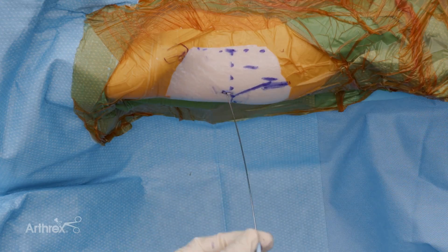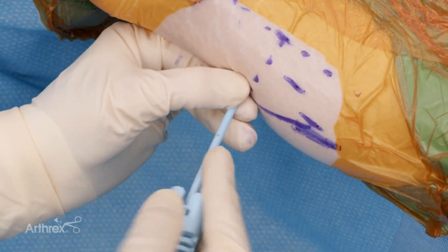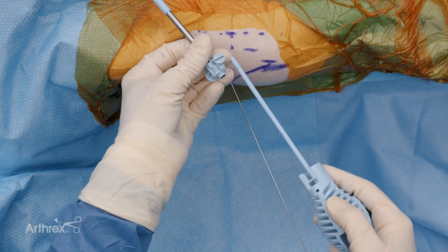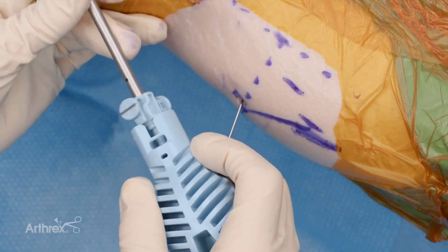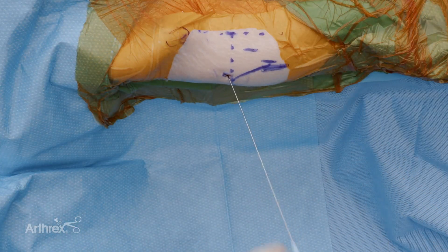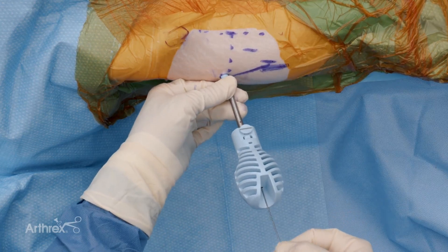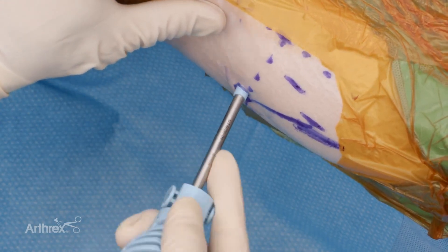We bring the flush fit to the tip of the wire, hold the wire in position, and twist-push down to the level of the hip capsule. As we work into that hip capsule, we're working with twisting — we don't want to see bending or excessive force; this is all part of protecting the patient. Next, we connect the flush fit obturator into the cannula, making sure the chin-up bar portion of the flush fit obturator is aligned with the line on the flush fit cannula. We're then ready to instrument down the nitinol wire and into the hip joint itself, using the wire position to confirm correct angle — if the angle is incorrect, the wire will bind inside the cannula.